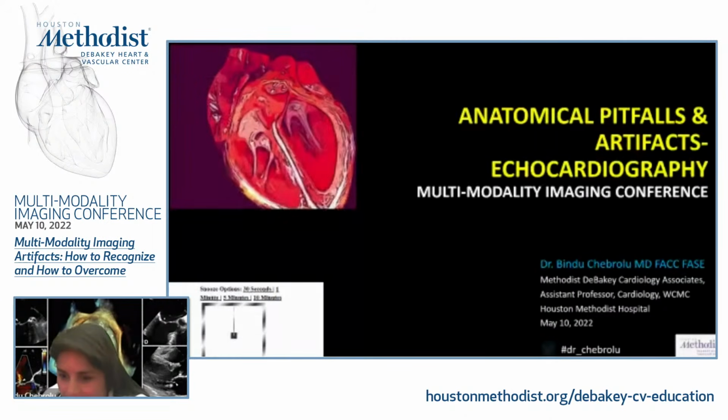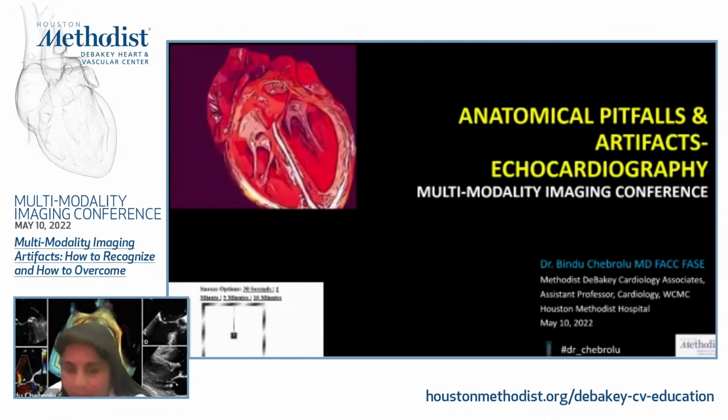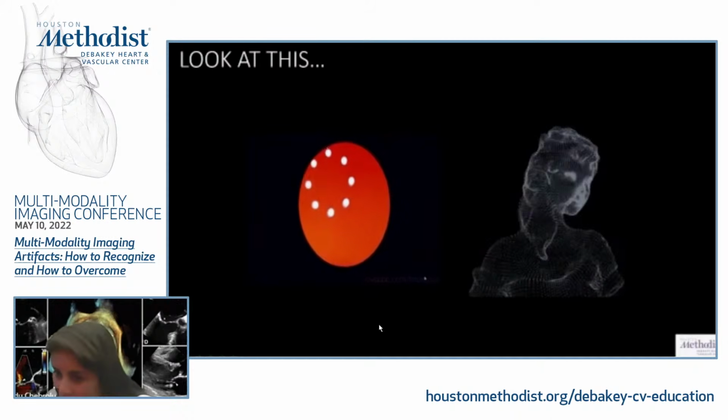So my goal today is to go over some of the basic artifacts we encounter on a daily basis, and learn the mechanism and tips on avoiding them. Sadly, I don't have any disclosures. Now let's take a quick look at this video.